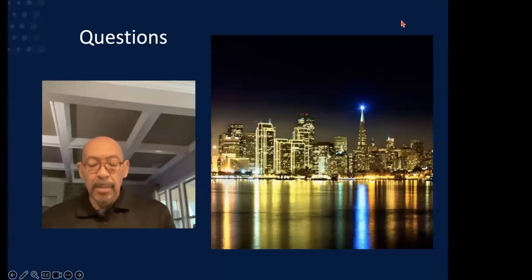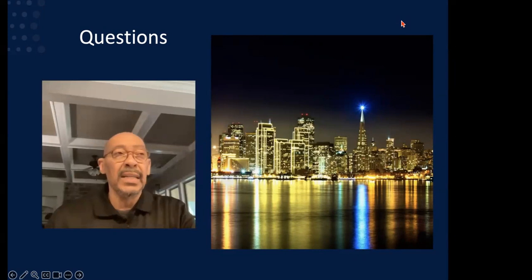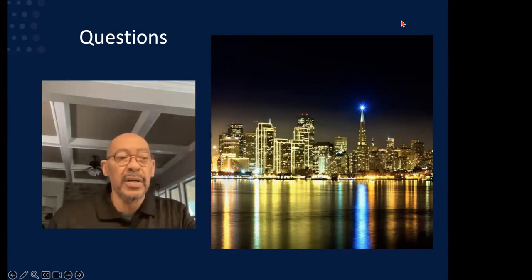So the reason I say the answer depends is it depends on the age of the surgery and the lens. It depends on the skill of the surgeon. It depends on the philosophy of that surgeon's clinic, whether or not they enjoy doing that type of surgery. And so that is a good discussion that someone may want to have with their doctor when this lens is available: hey, I'd like to get one or both of those technologies put in my eye. Is that something you would be willing to do? Because there's a lot of variability there and a lot of complexity associated with taking out a lens that's been in the eye for long. It's not impossible. I'm not saying you can't do it. I'm just saying that you really have to have that discussion with your doctor.